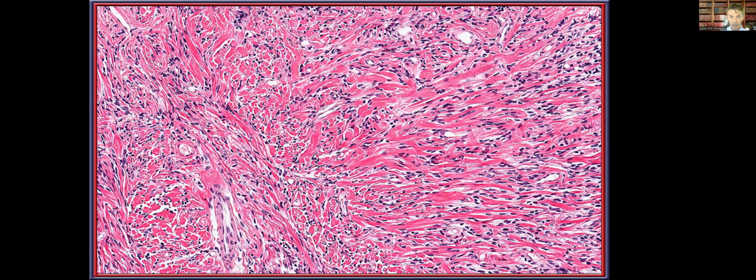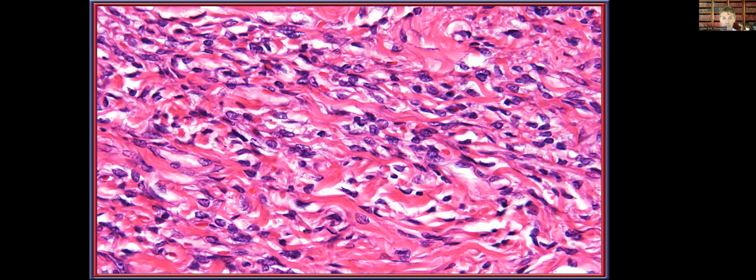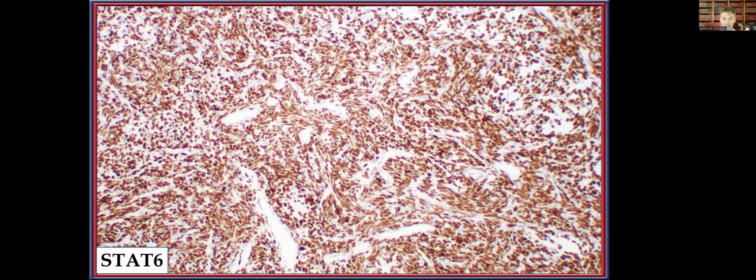Here is a more characteristic area with abundant areas of keloid-like collagen deposition that kind of overshadow the fibroblastic type proliferation in the background. But when you go up to high power, it has this very ropey collagen type appearance, which is in fact quite refractile. So if you drop the substage condenser, you would see that type of refractility in these neoplastic cells.